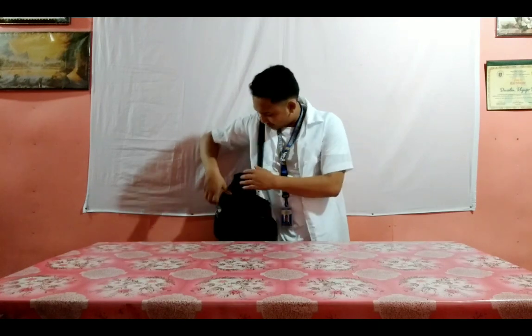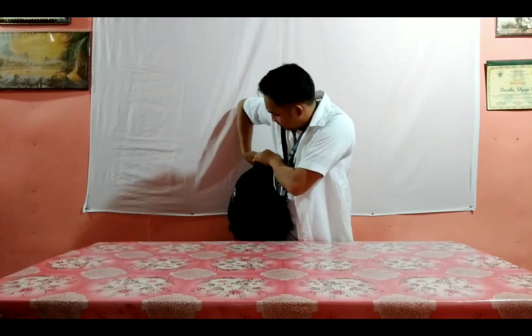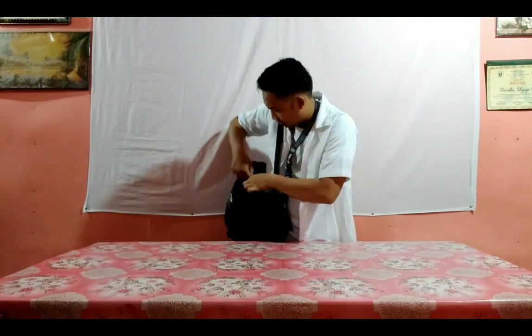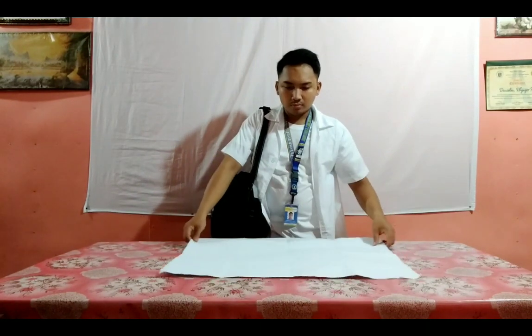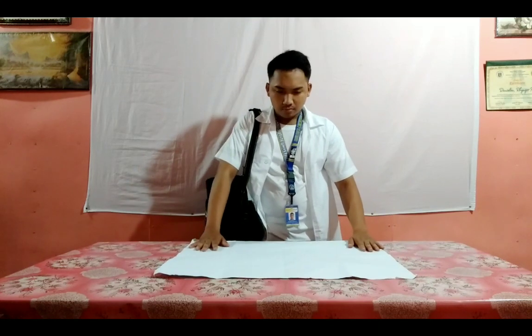Place the paper lining clean side out on a table or any clean, flat surface away from the client. Spread the plastic lining over the paper lining, clean side in.